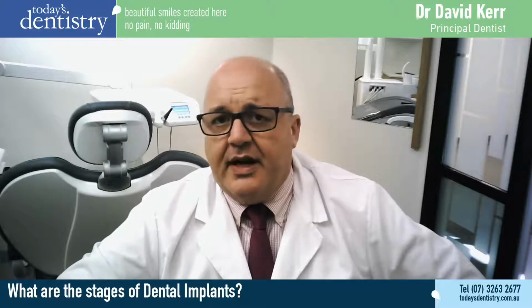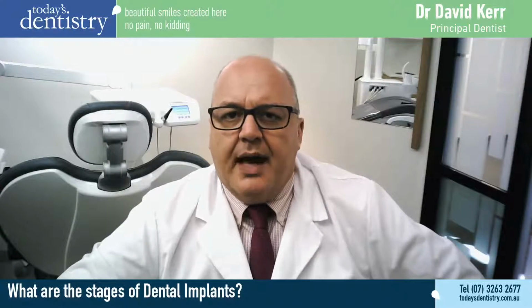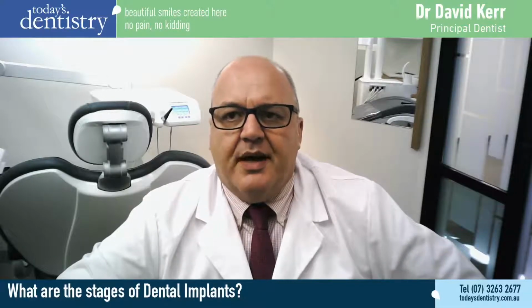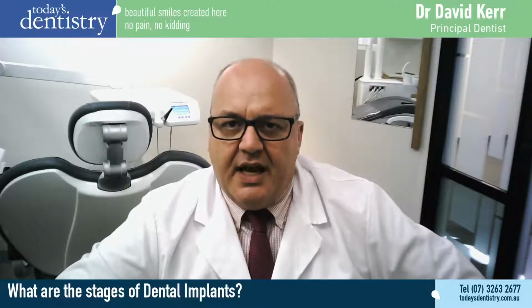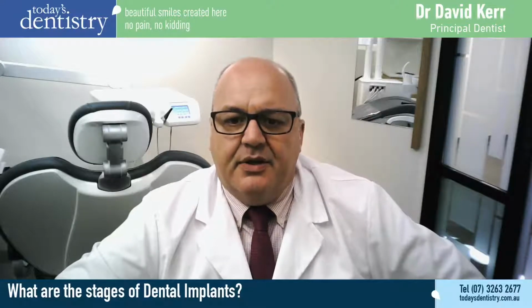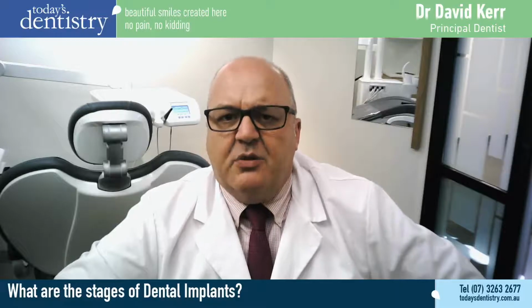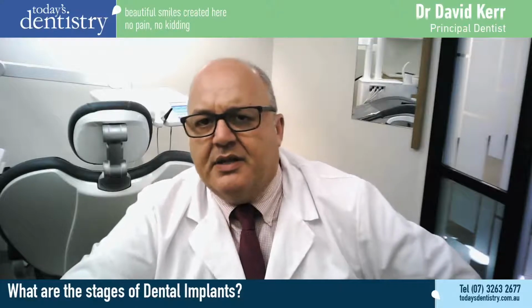One is in the form of a 3D X-ray, which is CT scan style, where we can really look at the tissues in 3 dimensions and know a lot about their volume. And the second thing that we like to know about is where we want the teeth to be. So in my case, what I often do is an intraoral scan of your teeth and in your mouth and work out where teeth need to be. We need to take a whole bunch of things into consideration, particularly if we're rehabilitating someone's teeth when they don't have any. We need to work out, certainly in terms of cosmetics and where we want things to go, and that dictates where the implants need to go.